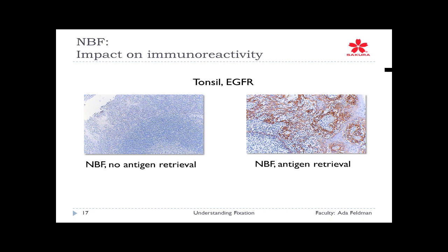And here's showing you what's going to happen with another specimen. This specimen is a routine tonsil, okay, that came from a clinical lab, all right. It's demonstrating EGFR, epidermal growth factor receptor. And here's showing if you happen to have skipped antigen retrieval with NBF, you get negative staining. It's got to be done.